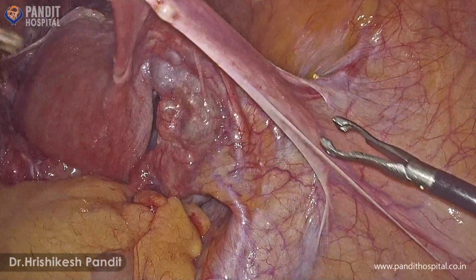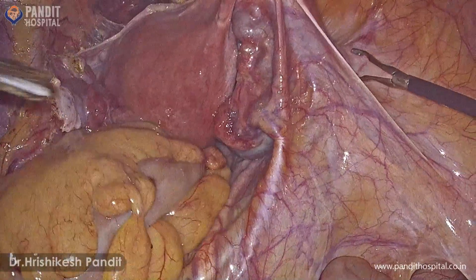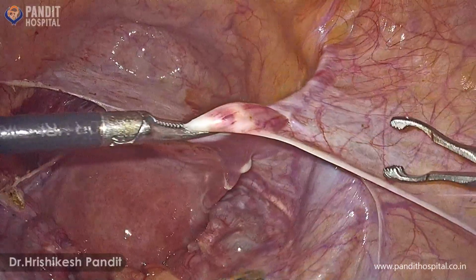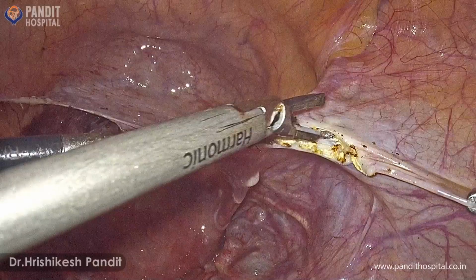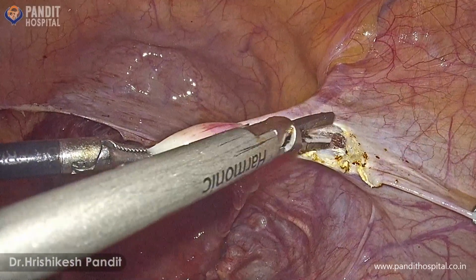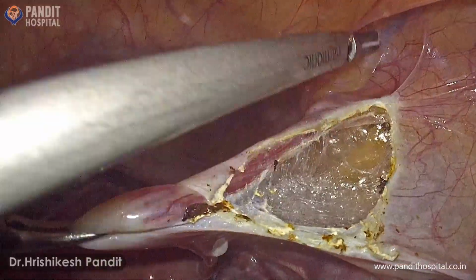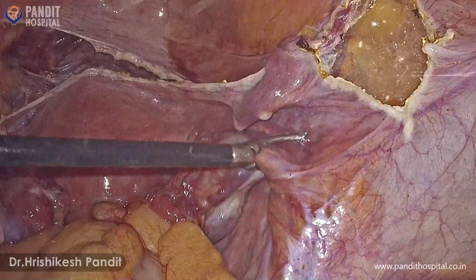Next step is opening of retroperitoneum by oncological or lateral approach and developing of all 6 avascular spaces. We start with opening the peritoneum by giving an incision from right round ligament till the right IP ligament as close to the lateral pelvic wall as possible.